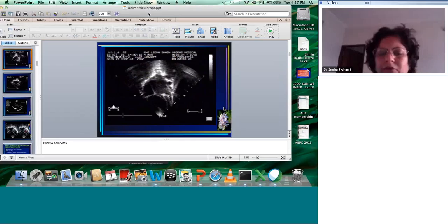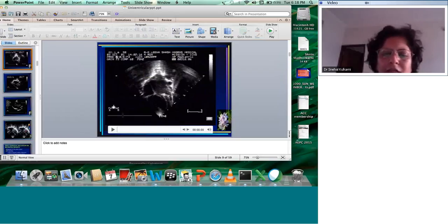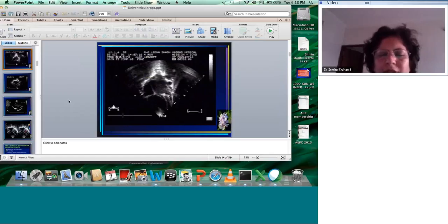This is a situation where we see the mitral valve which is atretic. We have a univentricular heart which is a morphological right ventricle. You see the interatrial septum, if you carefully see, it's going on the left side. That means your left atrial pressure is very high. You have a restrictive PFO, and many times that needs to be opened immediately.